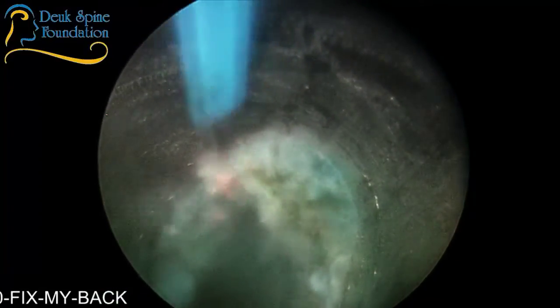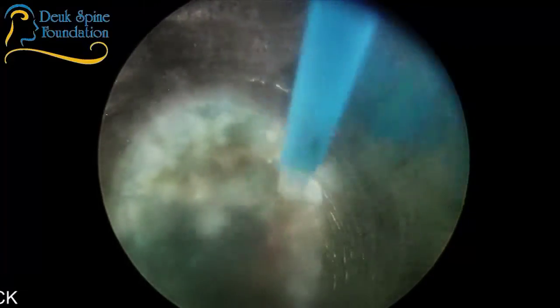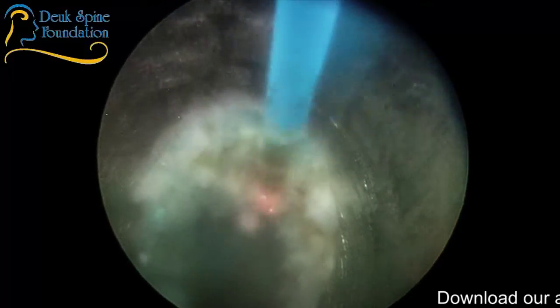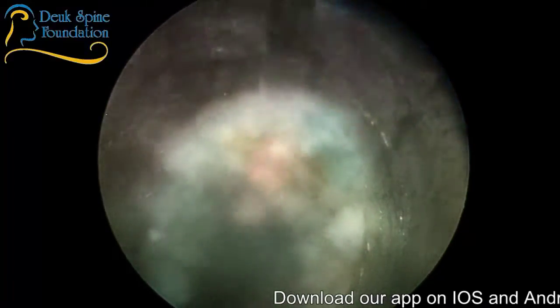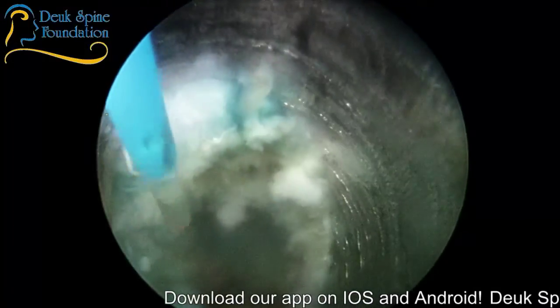You're looking through the endoscope with me. You're seeing the laser fiber working on the herniation and the annular tear. The annular tear is right here where I'm at. It's at 12 o'clock. And I'm using this straight firing Holmium YAG laser at 30 watts, right? And I'm vaporizing this tear. Look at the tear right there.